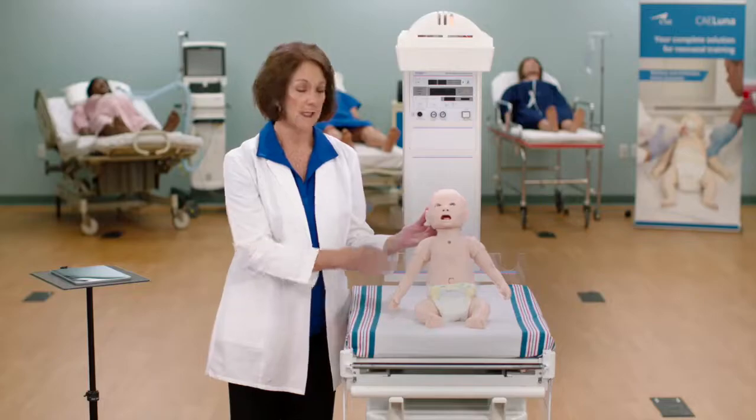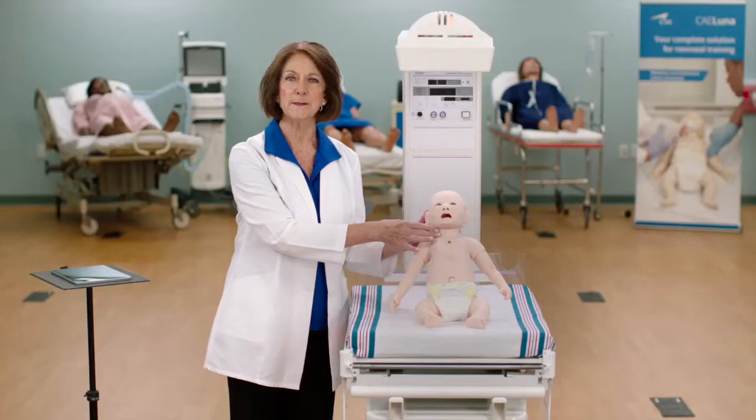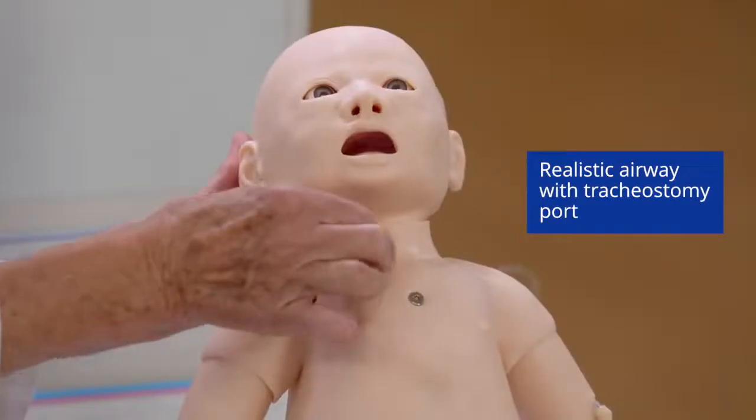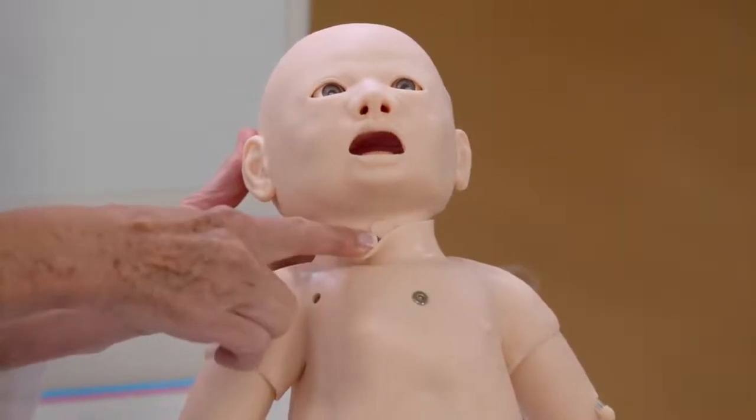Luna has a realistic airway that allows learners to practice basic assessment skills and life support skills. Luna's airway also includes a tracheostomy port for trach ventilation, care, and maintenance.